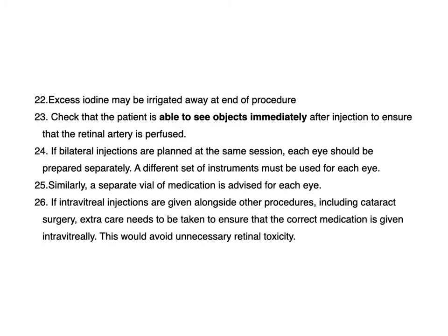And after injection, it is mandatory to assess that the patient is counting fingers to exclude central retinal artery occlusion that rarely happens. I encountered this situation once and with ocular massaging only the patient regained his vision within 2 minutes.